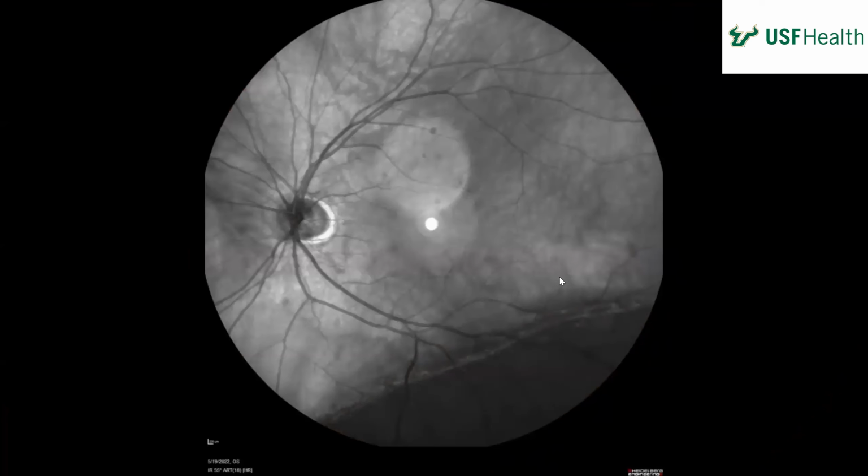What image is that? This infrared? Yeah. Okay, again with the left eye here, with IR image. Seeing a spot, is it reflectant? Yeah, reflective, so a hyperreflectant spot essentially in the macula. Yeah, that's an artifact. Your photographer can get rid of that if they pay attention. They just have to wiggle a little bit while capturing and you lose the spot. But it is technically a reflection. But then superior to that, that's probably another artifact. Okay.